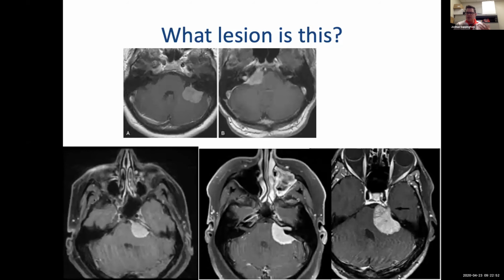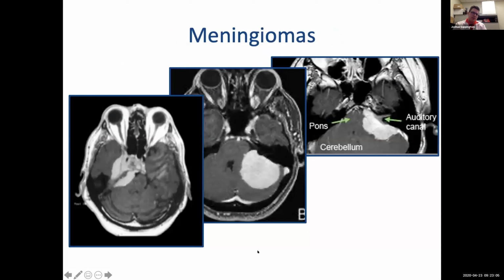It's always in the differential for a lesion that may be in the IAC. But for something like this, it's most likely a meningioma, and you're going to manage it.